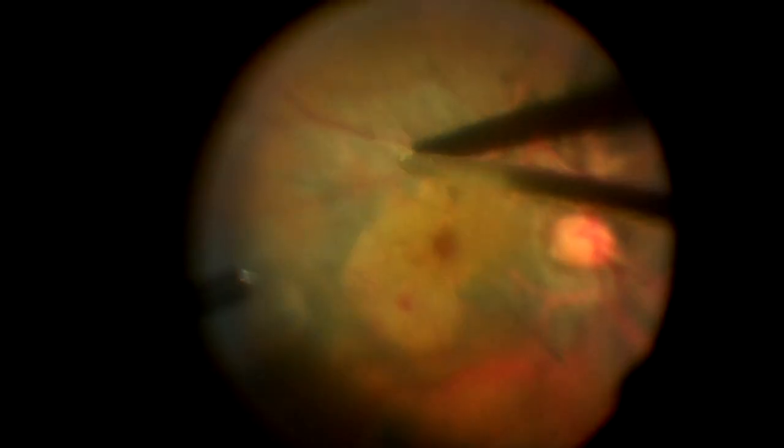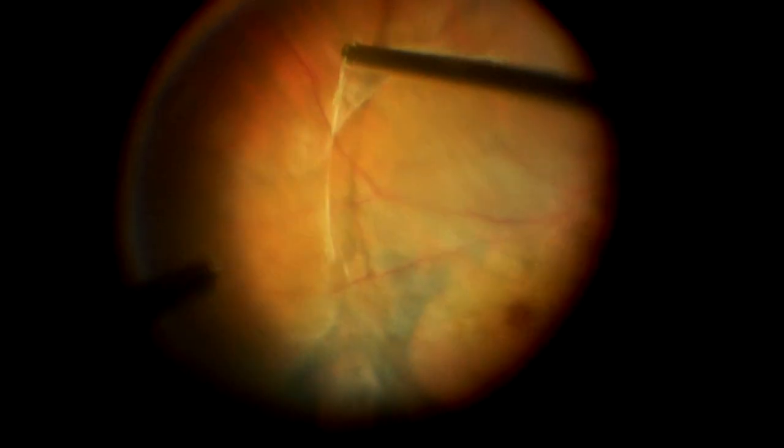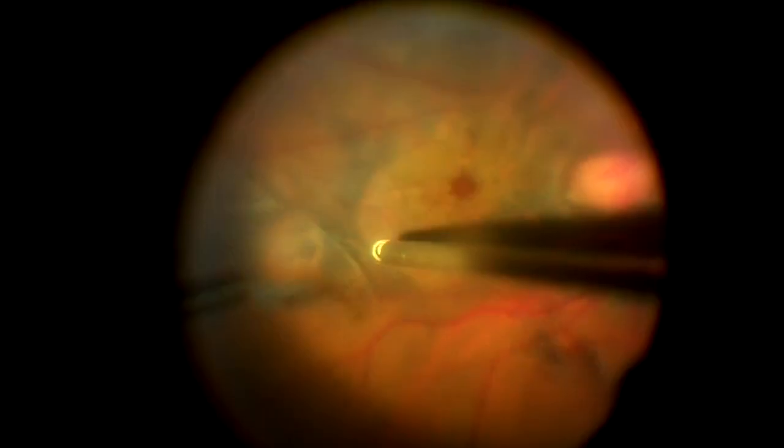In this case, even though I am carefully trying to put that ILM onto the hole area, I will be losing that. So once you lose that, don't lose hope. You still have the nasal ILM to put into the hole so that an ILM flap can be created. In this particular case, after the ILM is removed, because the hyaloid is on top of the ILM, I can very easily lift up that, because that gave me a guidance to where the hyaloid was.